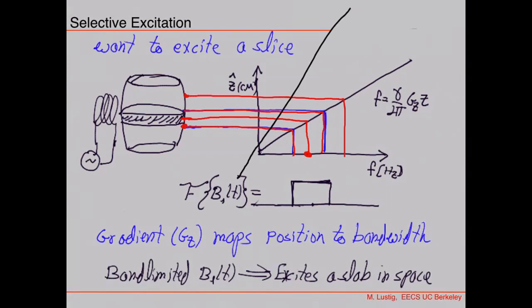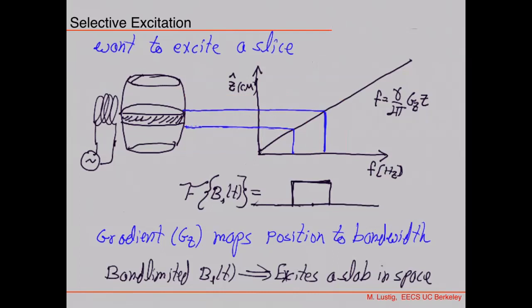And so now the mapping is going to be different, right? Everything will be different. So effectively, if let's say I apply a stronger gradient, then this place over here would map to here, and this one would map to here, right? So it would be much more narrow. Does that make sense? Okay. All right.